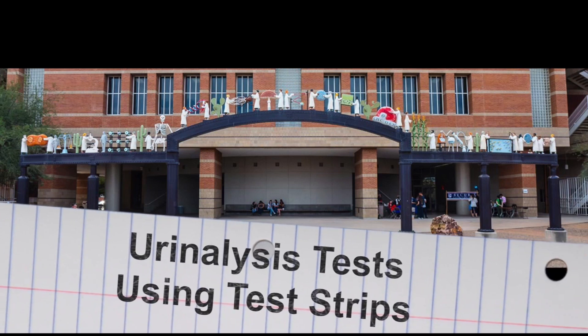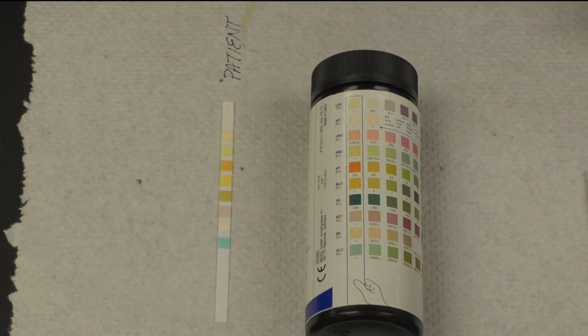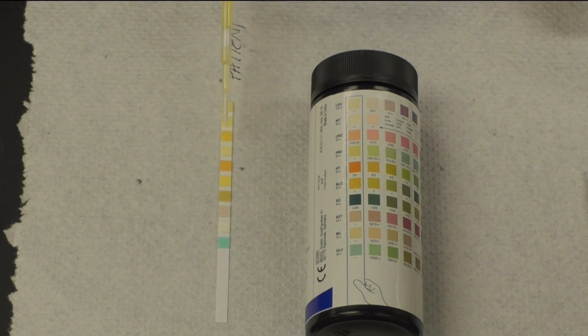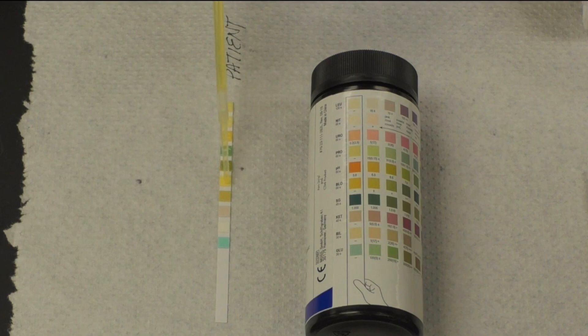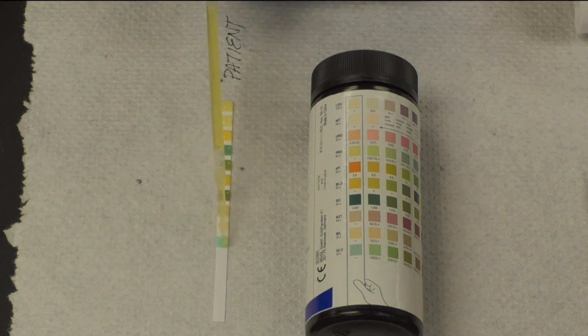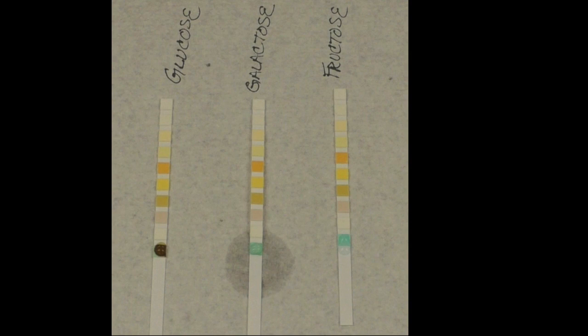This video will demonstrate the correct procedure for using reagent test strips to perform a urinalysis. Test strips are a quick and fairly inexpensive way to test urine for a wide variety of issues. The results will often provide guidance for further testing. The most important factors when using test strips are timing and your ability to interpret color. The tests are very specific, but can be skewed by other chemicals commonly used in labs.